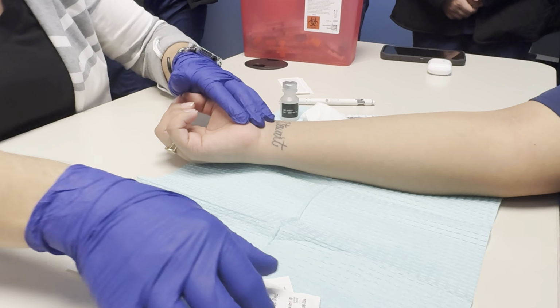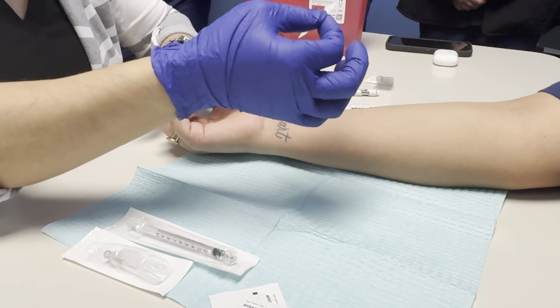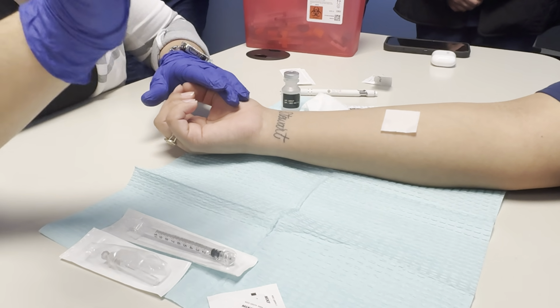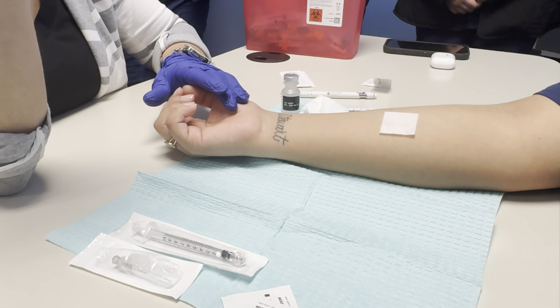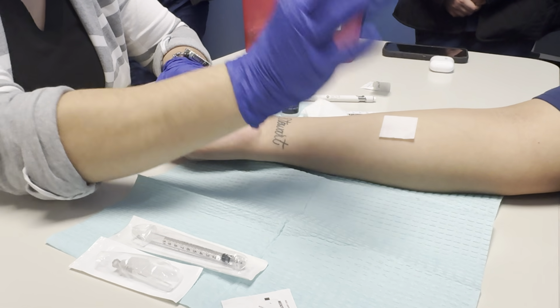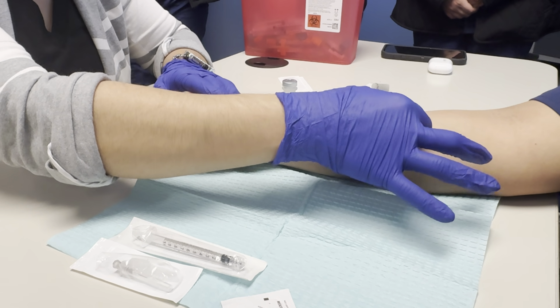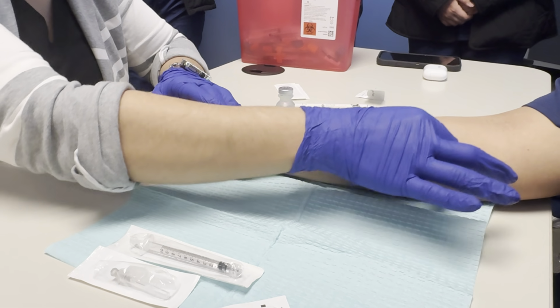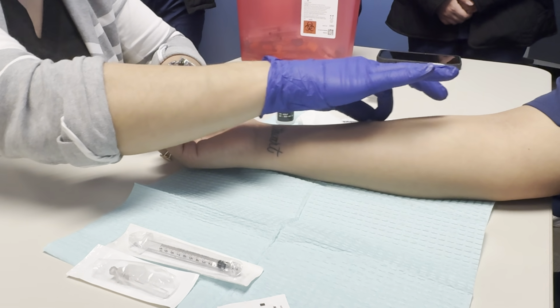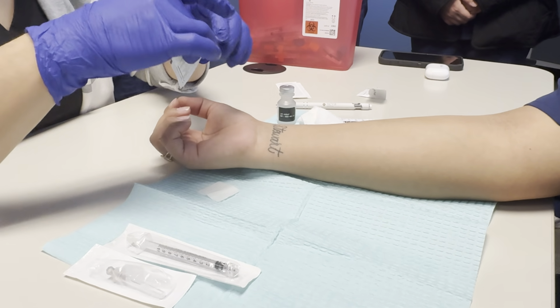Now that I know where I'm going, I'm going to grab my alcohol wipe. My patient does not have any allergies. Did you guys see how I grabbed it from the side? I'm not grabbing it otherwise because my gloves are not clean, even though they're gloves. I grab it from the side and put it right on my patient, and I hold it from the middle. I'm going to make a circular motion two inches away from the area you want to go. It never ever hurts. Can you see? It never ever hurts.